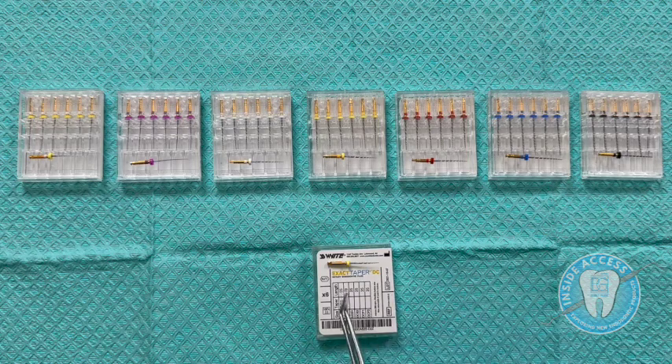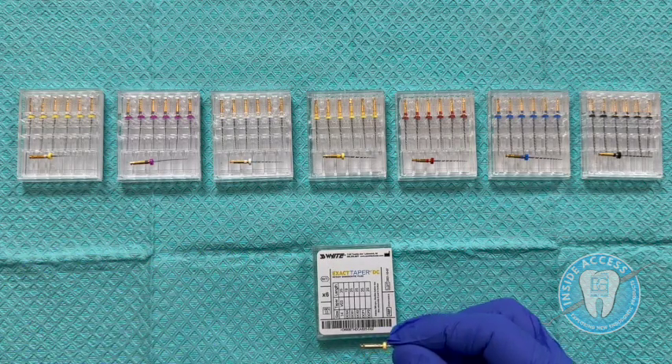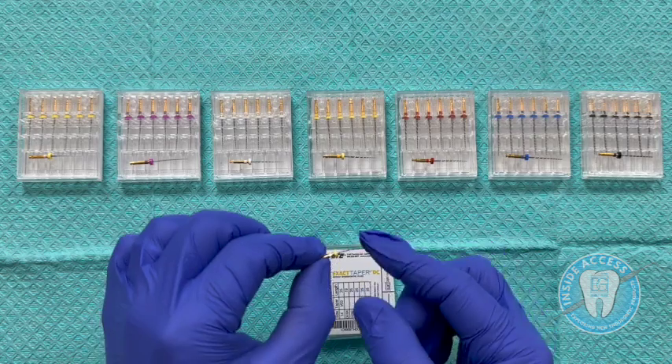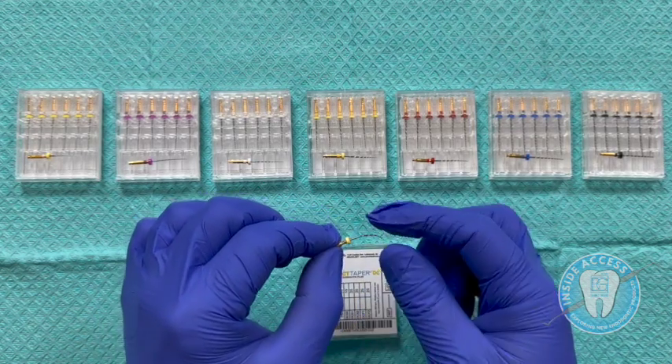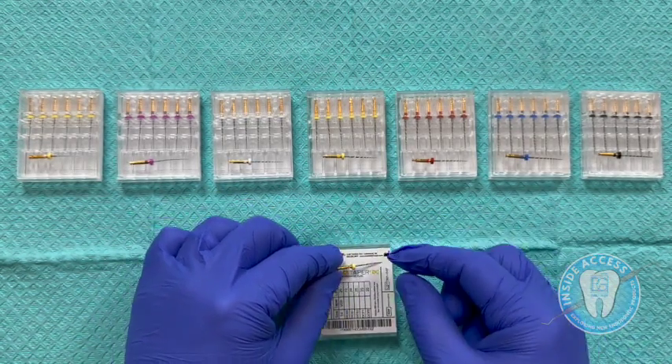I felt intrigued by that claim and wanted to put them to the test to see if this file system really lived up to the billing. Let's take a deeper look into the ExactTaper DC filing system from SS White Dental. It all starts with the SX — this is your orifice shaper. It has a 15 at the tip with a 0.09 taper. You can see excellent control memory, and that's consistent across the entire system.